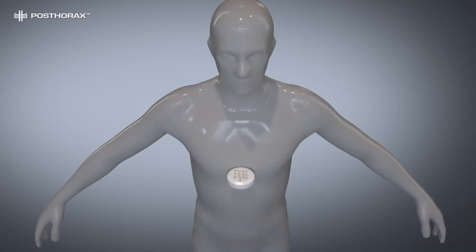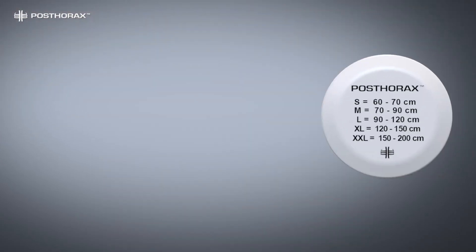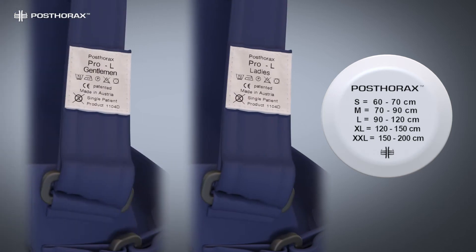Measure the upper chest with a tape measure, directly under the shoulders. With this measurement, choose the right size: small, medium, large, extra-large, and double extra-large — women's or men's model.